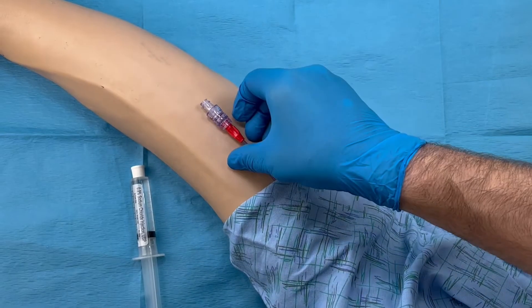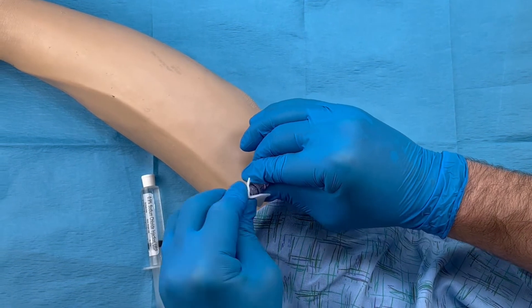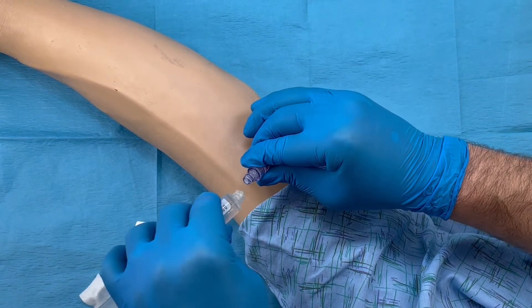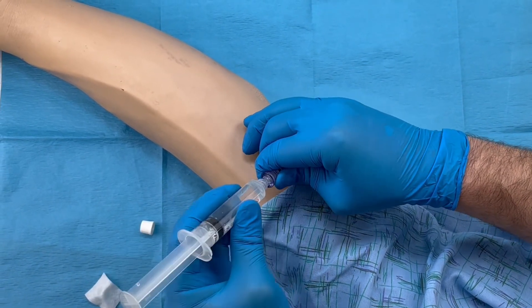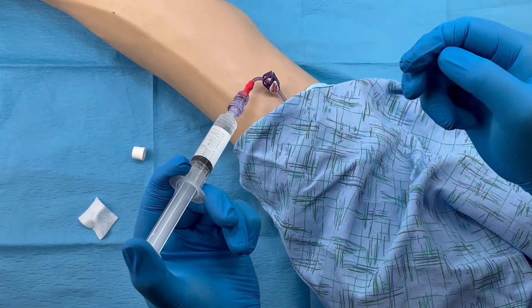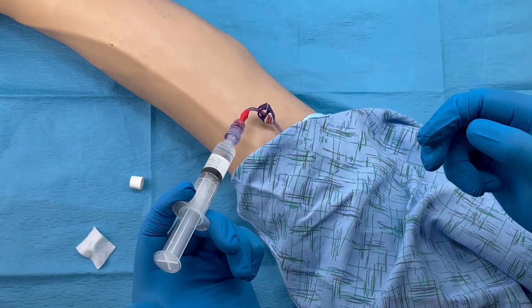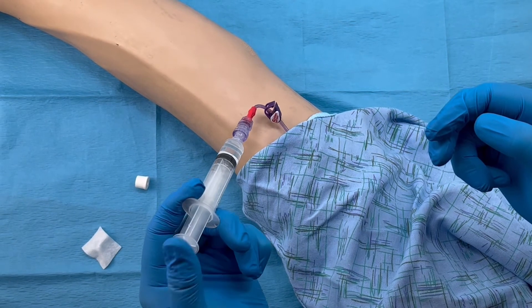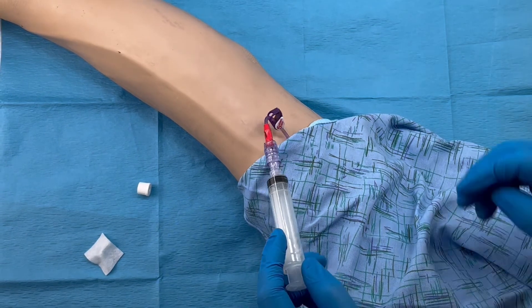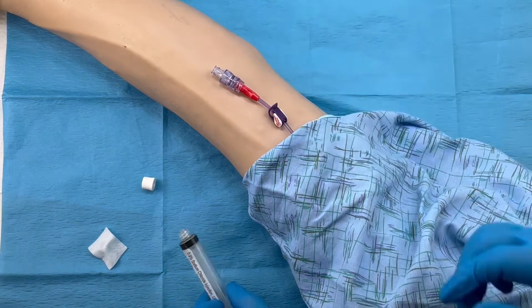Once the TKO is connected to your catheter, swab the top of the TKO for a minimum of 10 seconds with an alcohol prep pad and allow to dry. Push and turn the flushing syringe clockwise until the luer tip is securely fastened to the TKO, open the clamp, and flush using the pulsatile flushing technique recommended by the 2021 infusion therapy standard of practice. Close the clamp prior to disconnection, and remember to grab the TKO when changing your connector to avoid disconnecting the entire tube set.